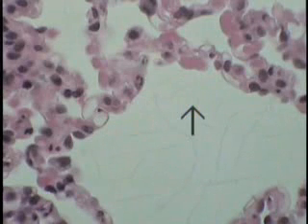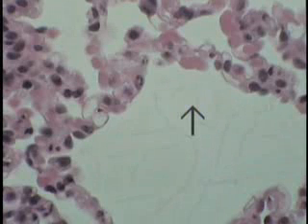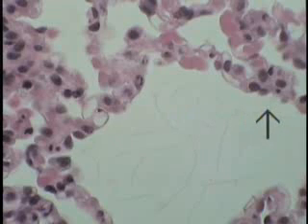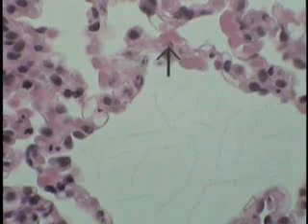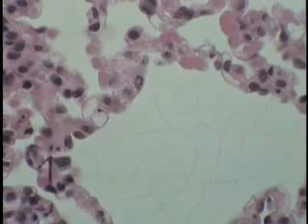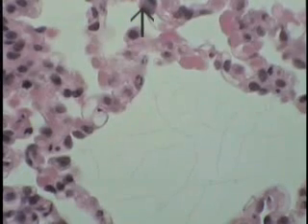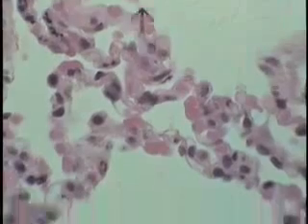This is a portion of lung in the plastic embedded material, stained with hematoxylin eosin and viewed at high magnification. What is shown in the field of view is the alveolar wall, which is coursing roughly in this position. Another alveolus is shown here, another one up here, and so this is that lacy type of material one sees in the background.